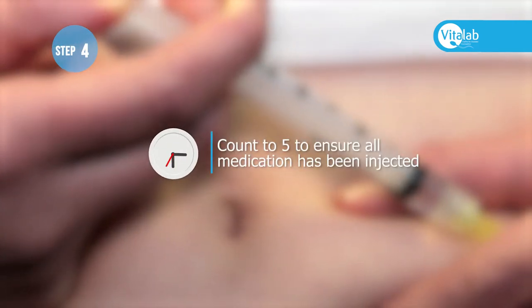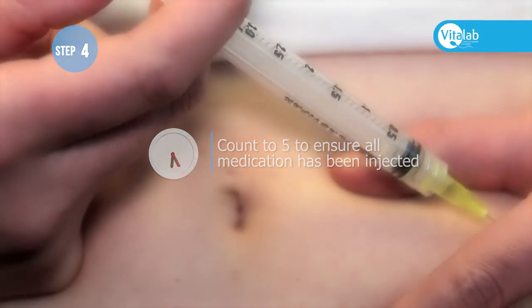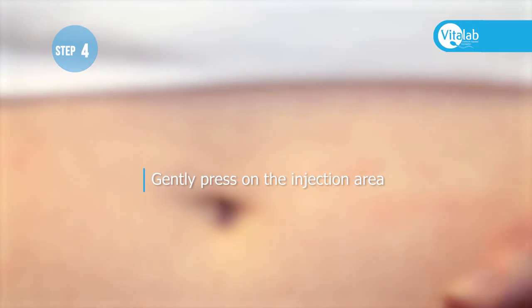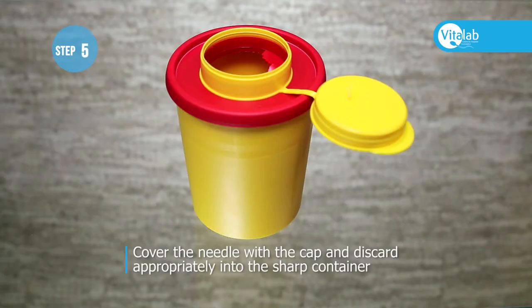Then pull the needle out and gently press on the injection area. Cover the needle with the cap and discard appropriately into the sharps container.